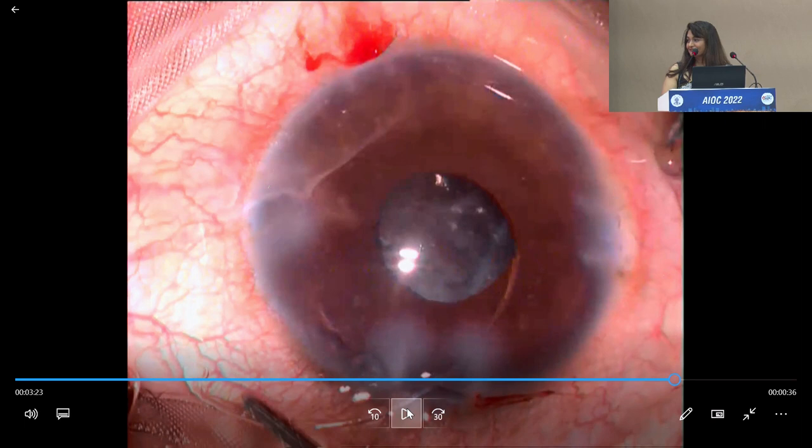Actually, it's too small, and the cuts were not really uniform. All these thoughts had come, but I was not very sure whether I would cause more damage with all these things. Basically, you were thinking you have made your rexis in the second plane with the scissor. With the scissor, yes. But you actually had a true rexis on top. Yes, exactly, true.